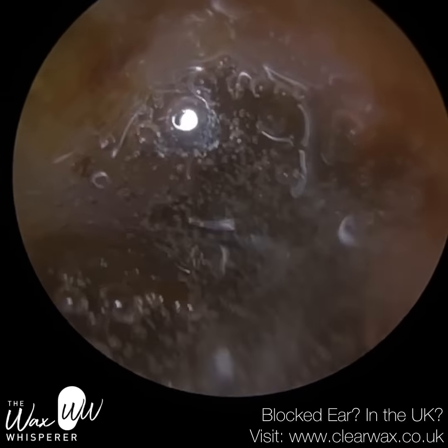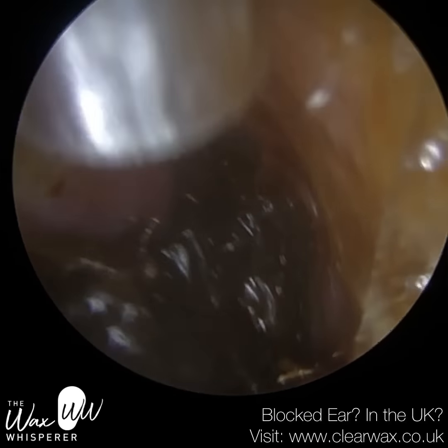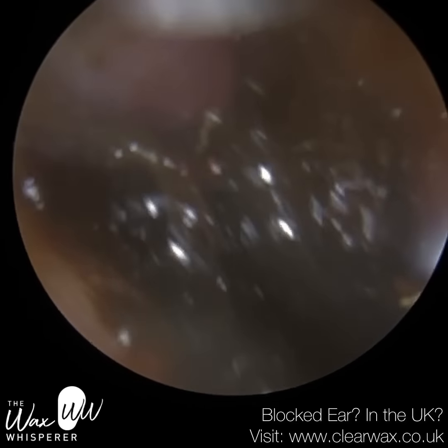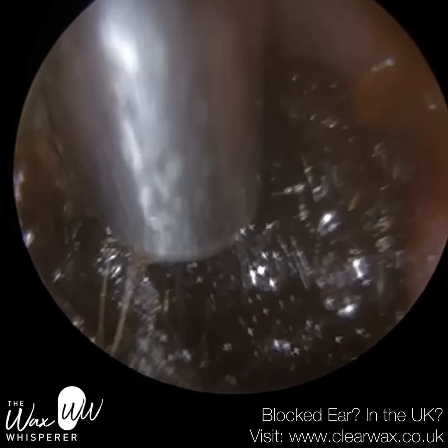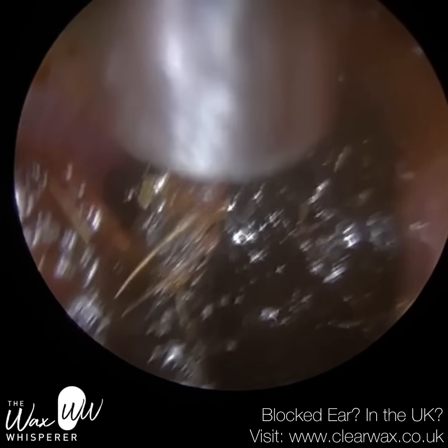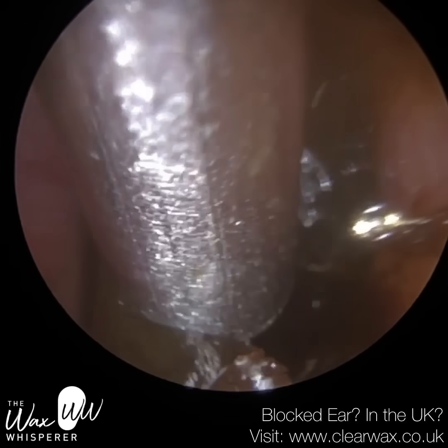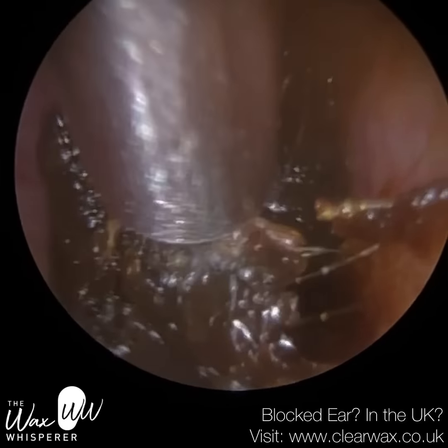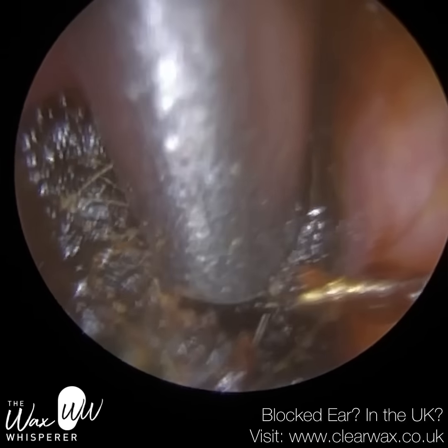I'm just going to instil some medical grade olive oil spray. The reason we use medical grade olive oil is because it goes through a number of additional processes to ensure there's no bacteria in the oil itself. A lot of people use regular home olive oil, but because we're using it for a medical healthcare procedure, I much prefer to use medical grade — you're far less likely to develop any reaction or introduce unwanted bacteria into the ear.